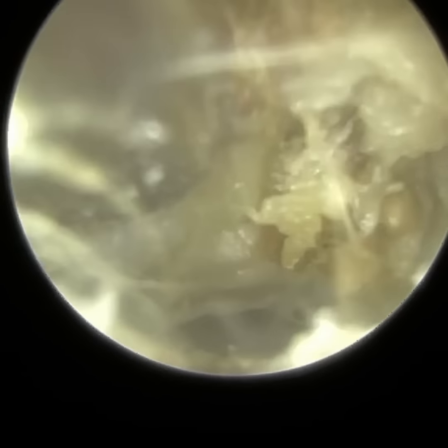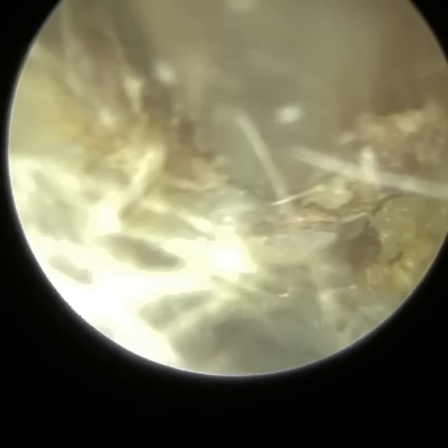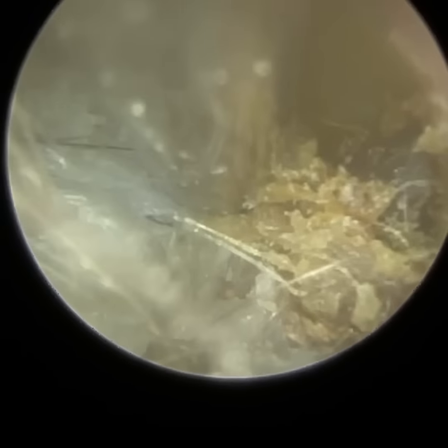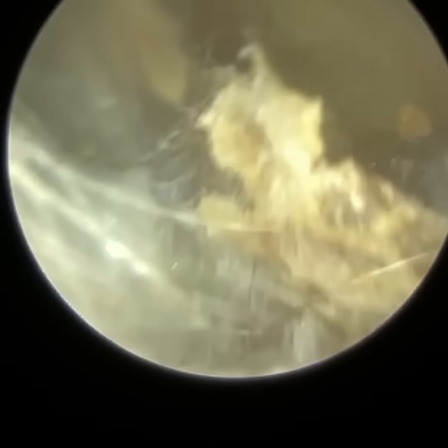There were layers and layers of dead skin here. What I'm trying to do is detach it from all the way around the periphery of the ear canal. In retrospect, you will see in a couple of minutes, I do use the forceps and I managed to get this main plug out. In retrospect, I probably should have used it a bit sooner, but what I was attempting was to detach it first and then use the forceps.